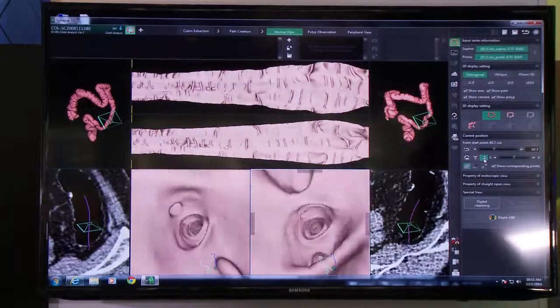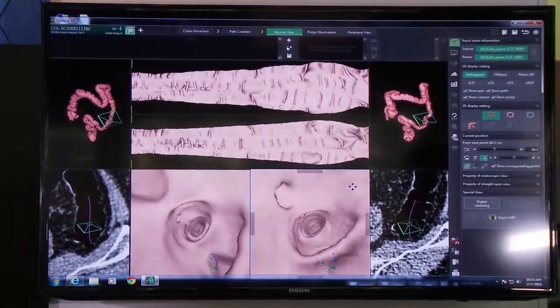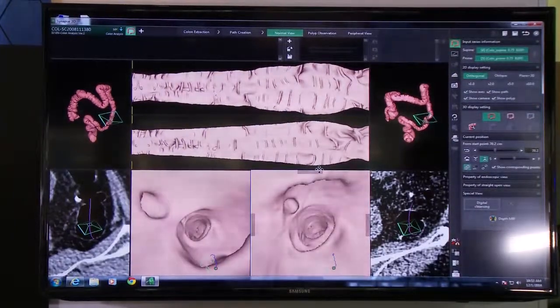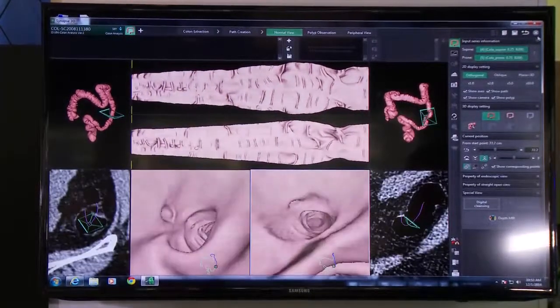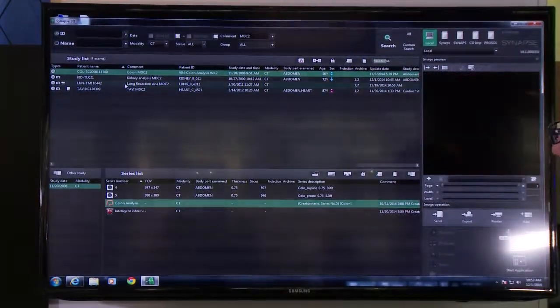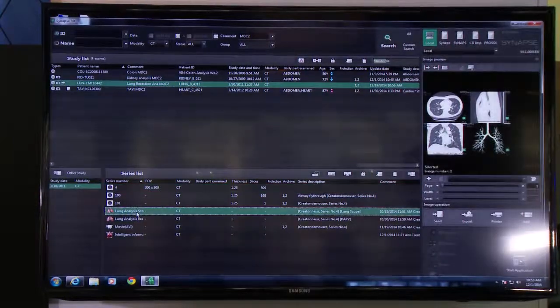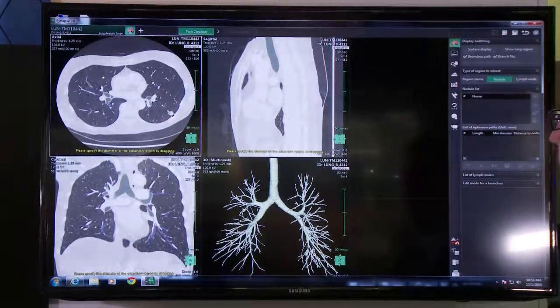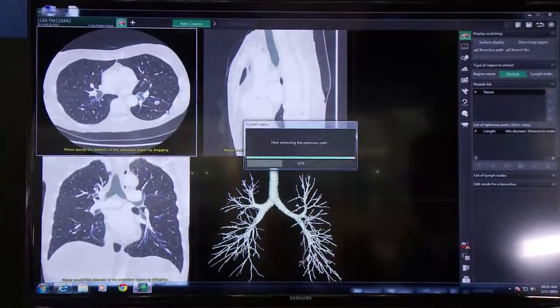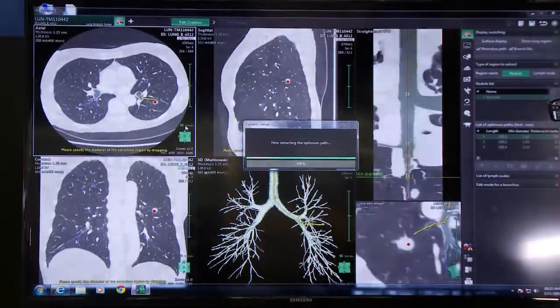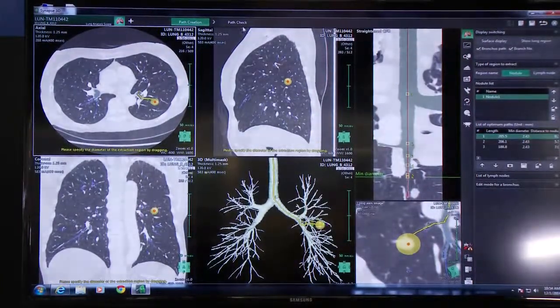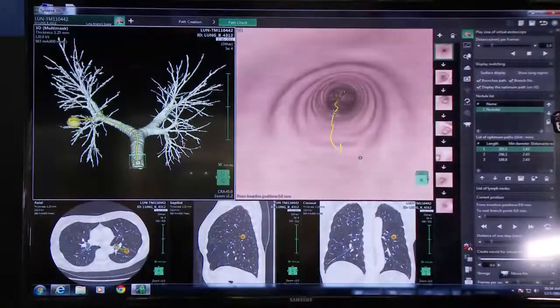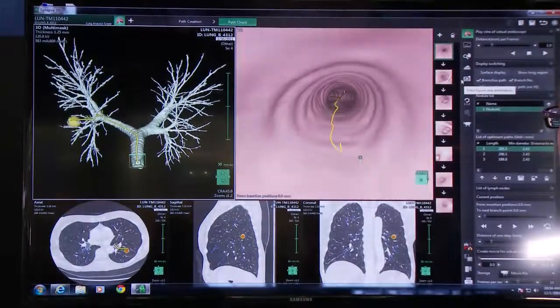So this is version 4.1 — we have approximately 11 new applications. Virtual colonoscopy is one of the new applications. We also have a new software called Lung Analysis Scope, which can be used to track a tumor and find the shortest distance to that tumor. I see a lesion here, I'm going to highlight that lesion. The system segments the bronchus and also segments the tumor. Now we can see the different paths to the tumor, and we can do a path check where we can see a virtual endoscopic view of the airway as well as the tumor.